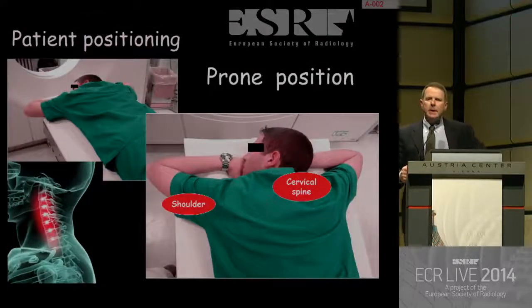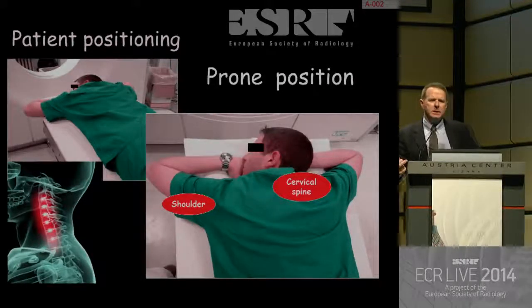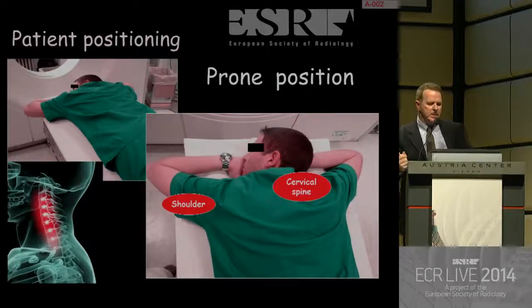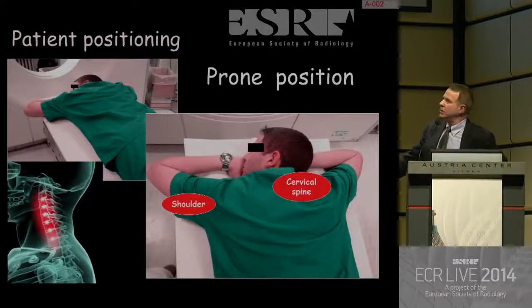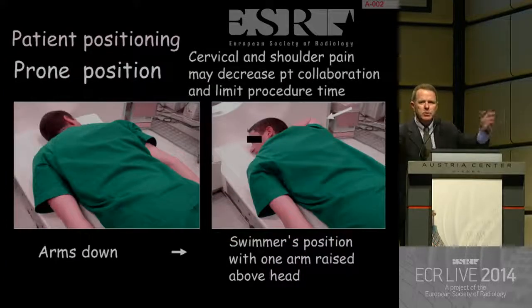Prone position. Some people say that prone position is good because they breathe less, they move less, and they see less. They don't see the needle. That's what the doctors like. Okay? But unfortunately, again, we may have shoulder pain and cervical pain. So sometimes, you know what we do?